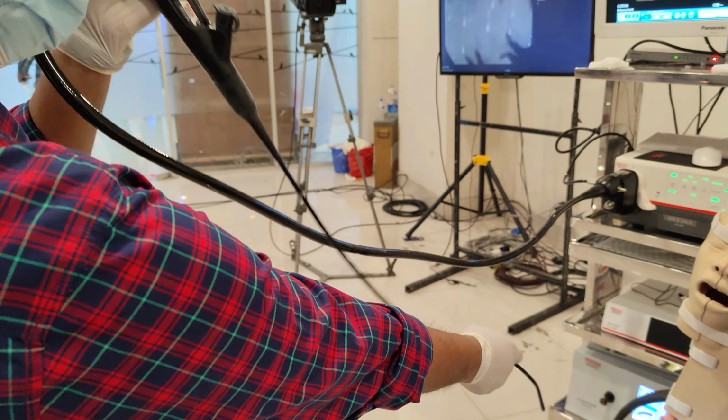Decongestant nasal drop and anesthetic lidocaine spray should be used in the nostril. For the anesthesia of the oropharynx, patient may gargle with 5 cc of viscous lidocaine. To anesthetize the vocal cord, lidocaine spray can be sprayed into the oropharynx while the patient inspires deeply.